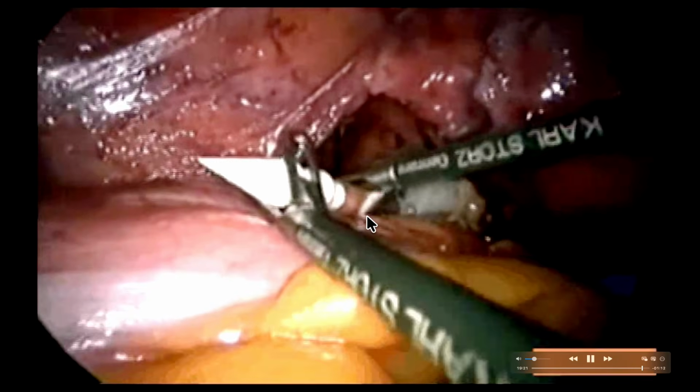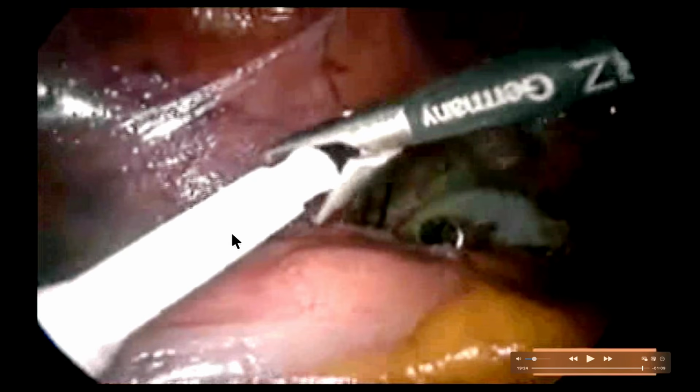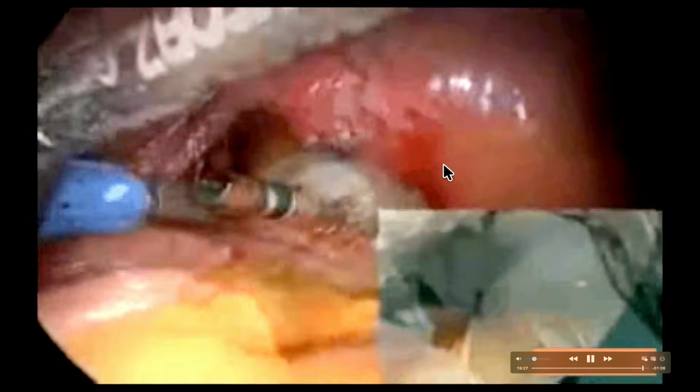After that you can remove this perforator. However, nowadays in the new perforator, there is a metal perforator inbuilt. There is no separate plastic one. But in some models, the plastic is separate.